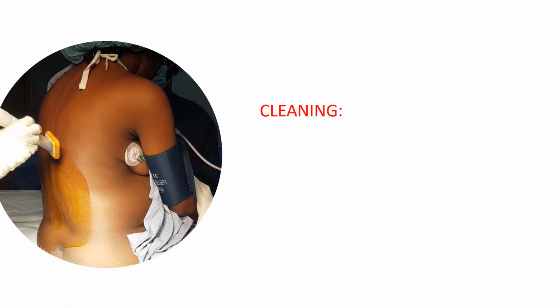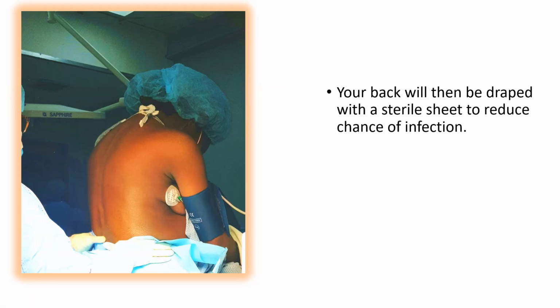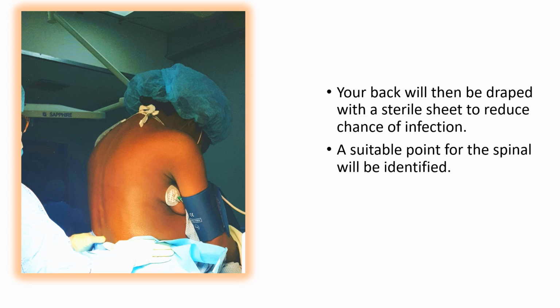Meticulous care will be taken to prevent infection. Your back will be cleaned with a special antiseptic, and this is to reduce the chance of infection. A large sterile drape will be placed over the lower back. After cleaning and draping, a suitable point for the spinal is identified.